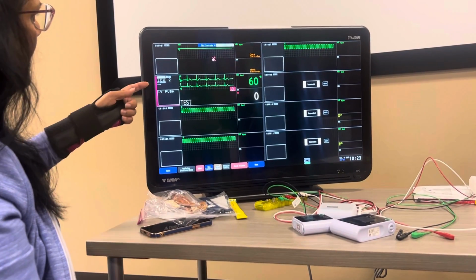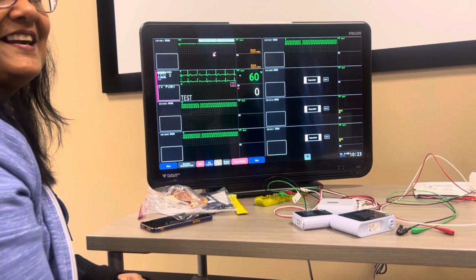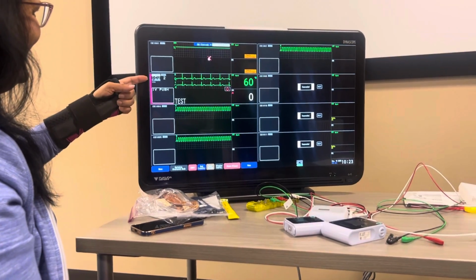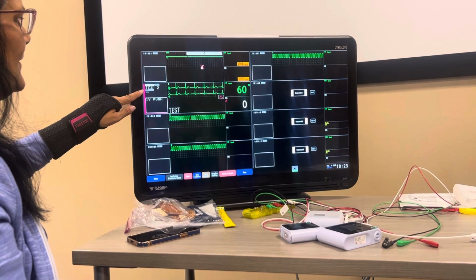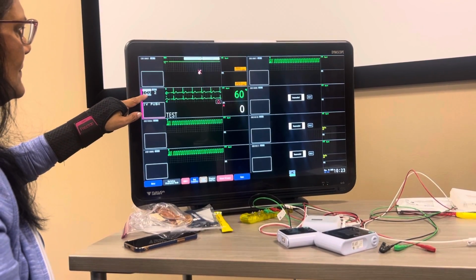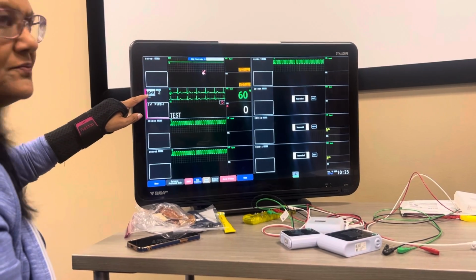Like, yes, we know the dog is in AIVR. It has been for 48 hours. It's fine. You see this little heart here? This tells me that I turned on the pacemaker.